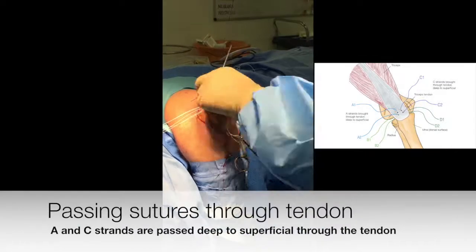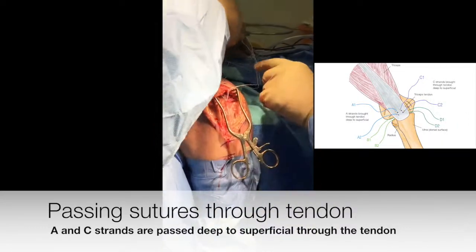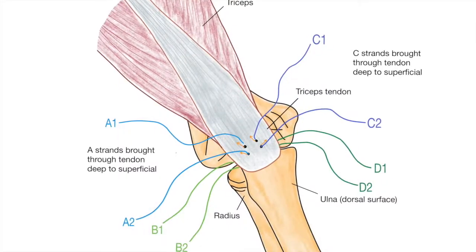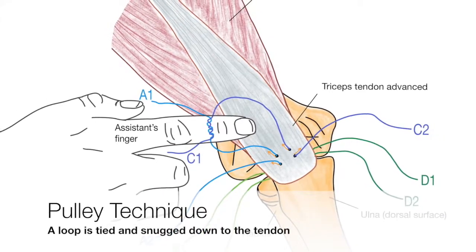With the proximal anchors in position, both ends of one strand from each anchor are passed through the tendon from deep to superficial. The pulley technique is then performed.